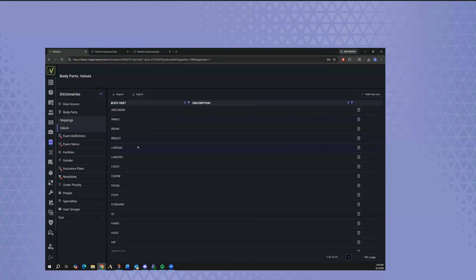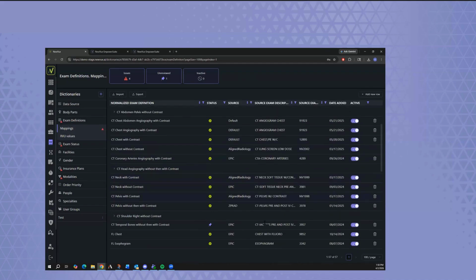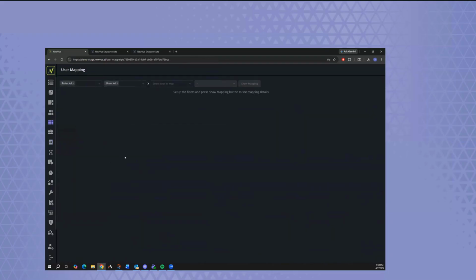But by doing that normalization process, the system is naturally resilient to changes, data onboarding, to typos and mistakes, right? So you can see an example here where this procedure has 7 or 8 apostrophes, probably not intended, could be a typo. The system can catch that and make sure that that doesn't disrupt the reading process. So very, very important foundation. But what do we do with all that? So we start with fault tolerance and resilience in the management of just processing orders and processing exams.